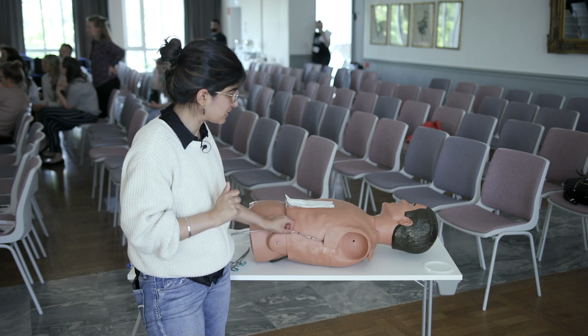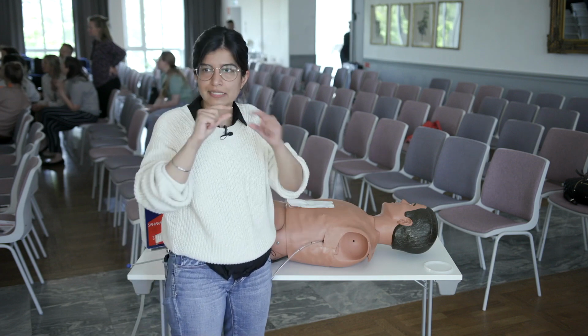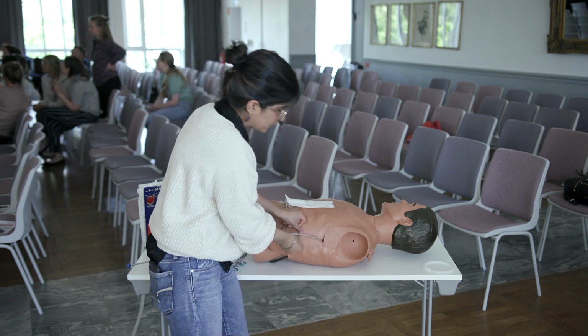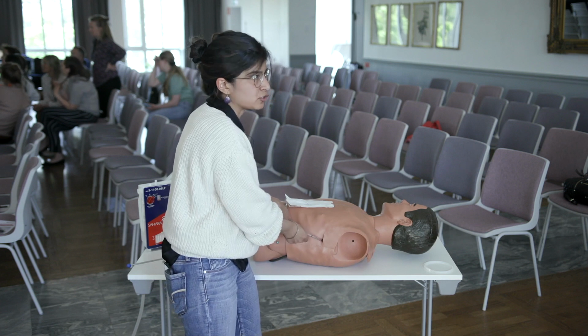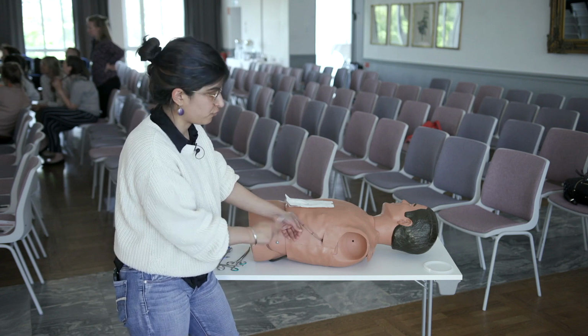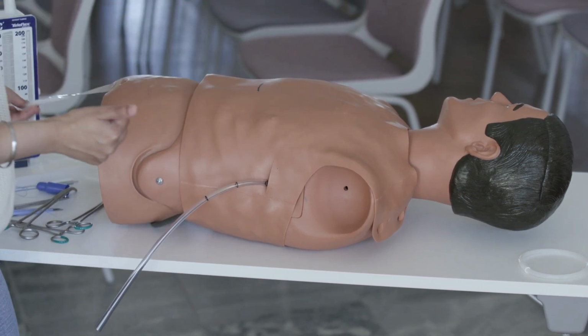And then the one thing I do is I make a mesentery. Everyone know what that is? Okay, that's fine. Someone else said that it was like the little StatLock. You can do it on the smaller drains, but you're not going to be able to fit one of those on here. So you just take a piece of silk tape, you wrap it around your drain, and you cinch it here, and then you attach that to the patient. Does that make sense? Okay, so it's not like you're slapping some tape on here. It's a wrap around the drain, put that to the patient, and that takes the tension off, like say this gets pulled or whatever, right? That takes the tension off the end of this. Okay? And you get a chest x-ray, and your patient's very happy.